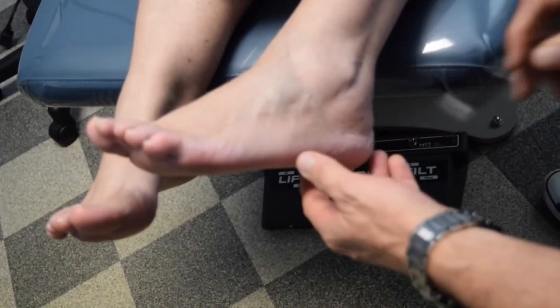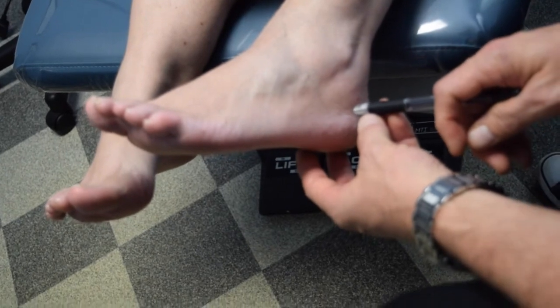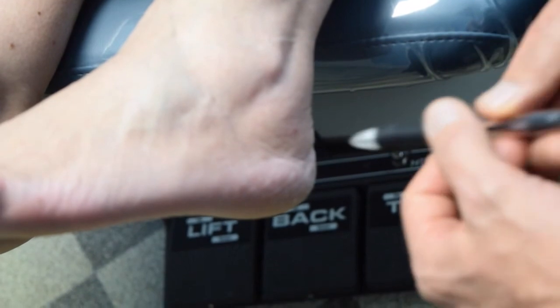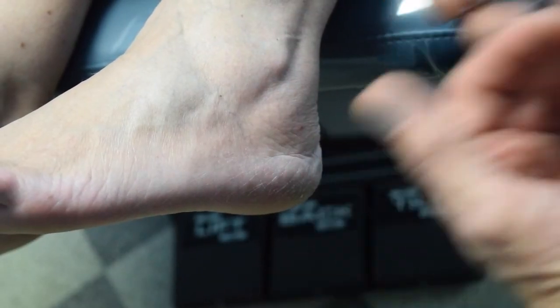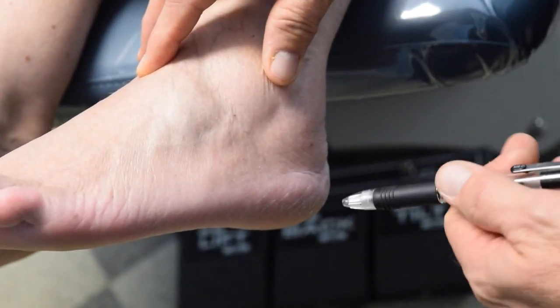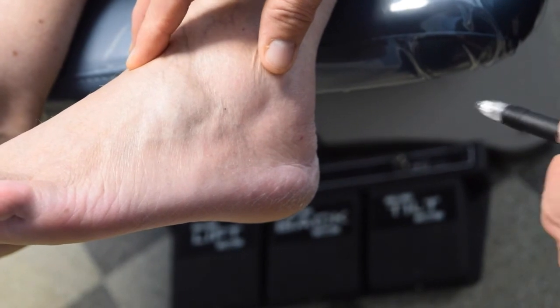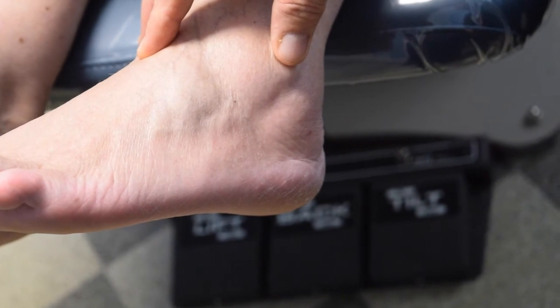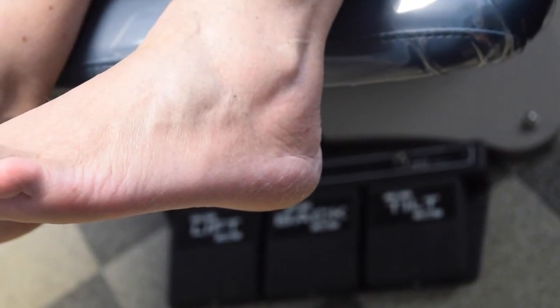If you look at the outside of her foot, you can see what we did — this is now four months post-op. We mapped out where the inflammation was, made a percutaneous incision here, and took our Isham burr and made three passes which allowed the heel to bleed out. This is an older technique not used a lot today in podiatry, but for these types of patients where plantar fascia releases, shockwave, and all the typical treatments have not worked, it's very applicable.